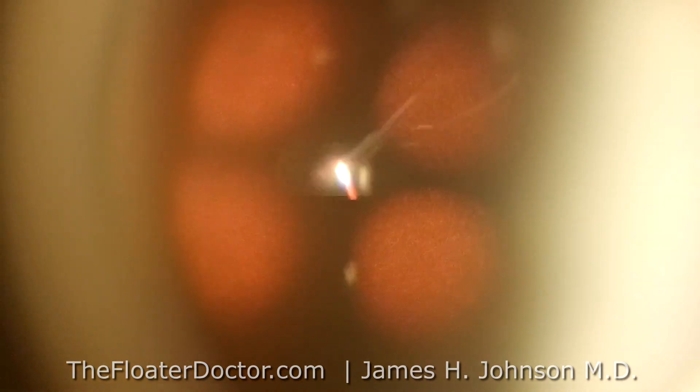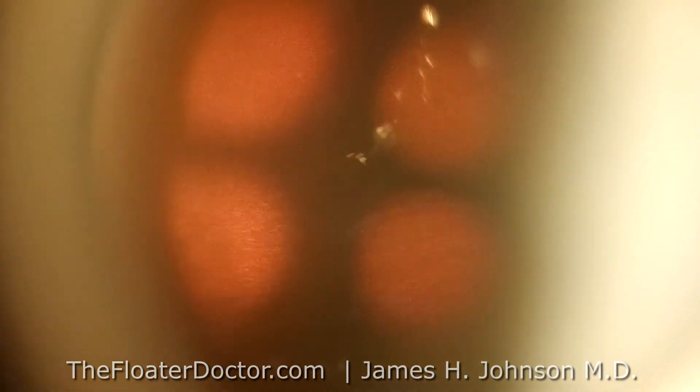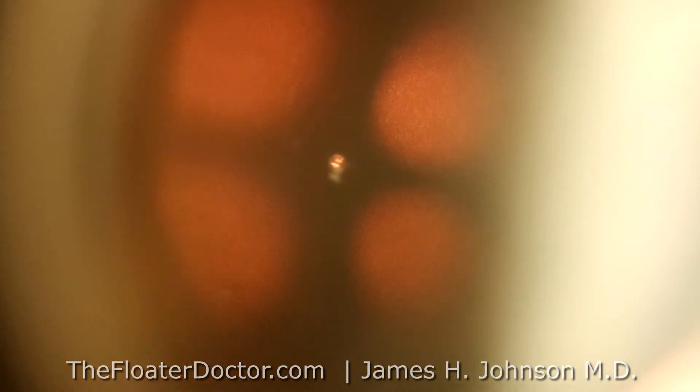As your vision recovers, you're going to see a lot of little dark things down in your lower field, towards your feet. Those are the gas bubbles sitting at the roof of the eye. Even though they're gas bubbles, they tend to cast little dark shadows — it's just the way the optics work. You'll see clustered little dark things and think it's floater debris — it's not. Those are round bubbles clustered together forming little gray clusters, and over 15 to 30 minutes they'll just dissolve and go away.